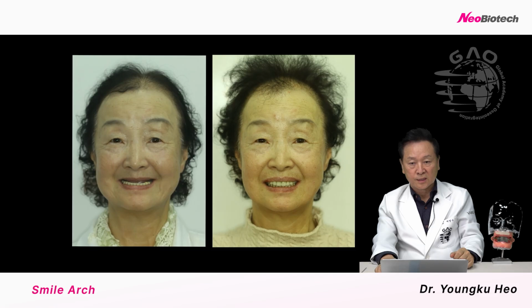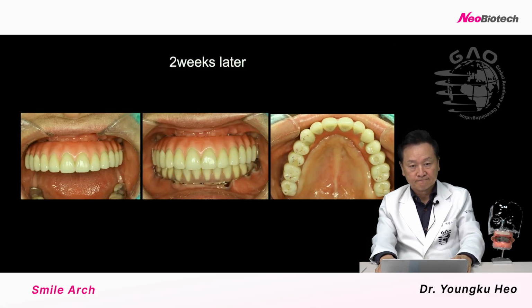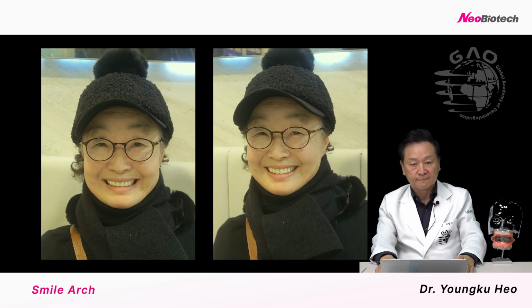So this is the magic, because we want faster delivery of not only the provisional but also the final restoration as soon as possible. So we finished this case in 5 days. And 2 weeks later, everything's perfect.